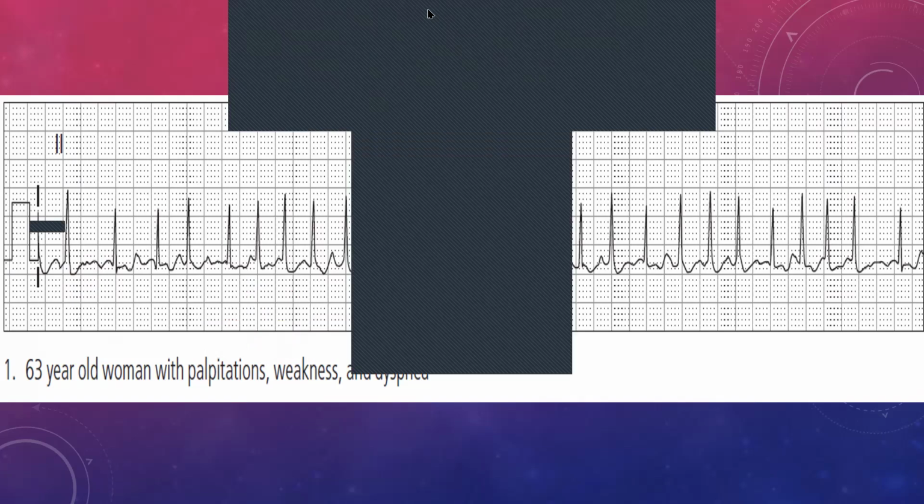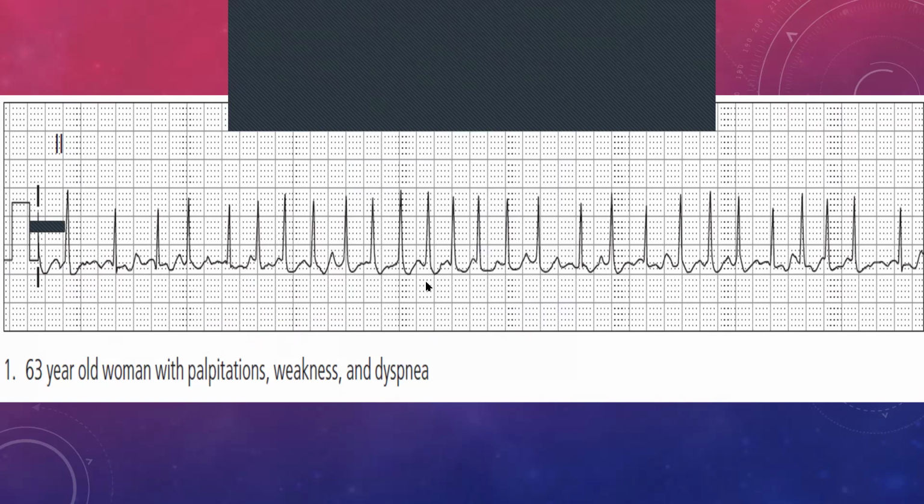So the AFib doesn't always present with the tachycardia. Very good question there. So there's two types of atrial fibrillation that we get. So we get slow AFib and we get fast AFib. Now, in this particular case, we're looking at fast AFib. Slow AFib is a less common variant that we do see, but it does occur. The management is slightly different. I'm trying to stay away from slow AFib in this particular one, the reason being I'm trying to stick more to the basic ECGs, but that's a very good question. There are the two types.